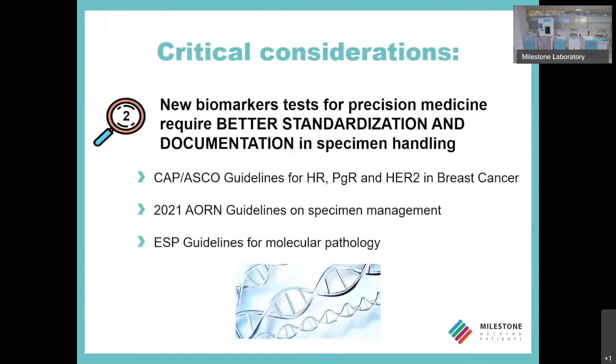There is another critical consideration that needs to be done in the biospecimen handling and collecting. The second critical aspect that I point out today is that we need to strongly consider the preservation of the molecular material of the biospecimen. In these past years, the progress in precision medicine and personalized treatment required additional tests in addition to the morphological evaluation, normally done by pathologists.